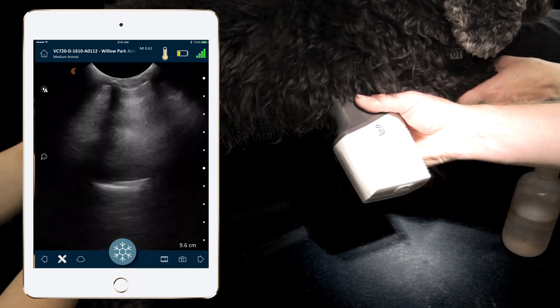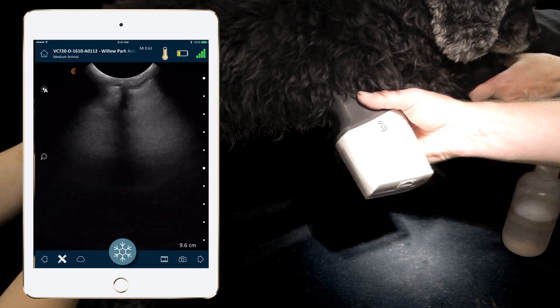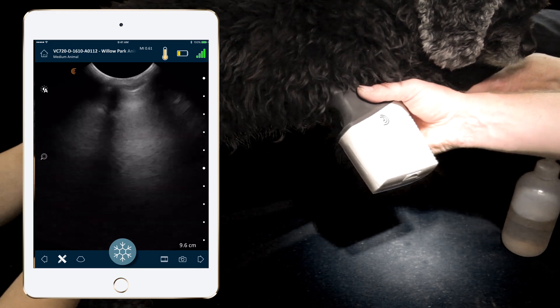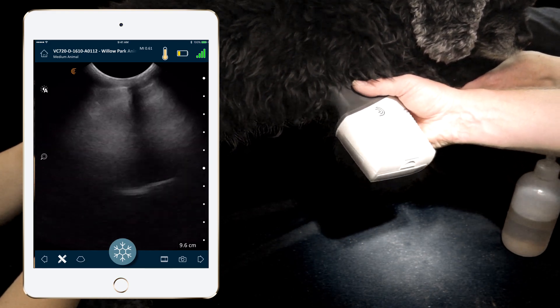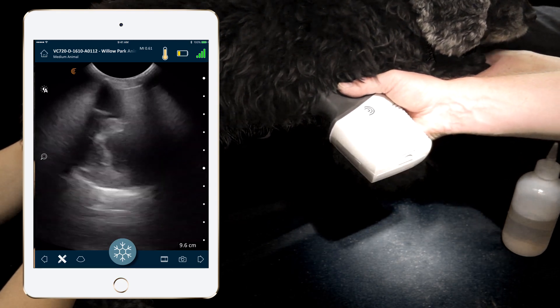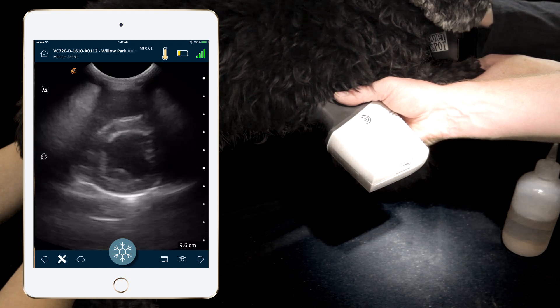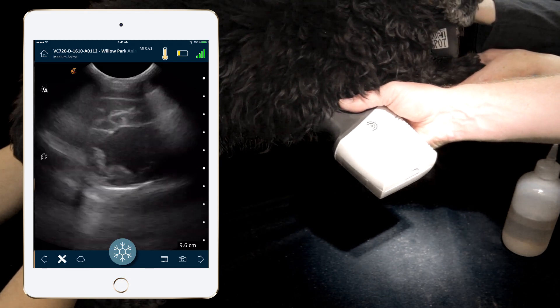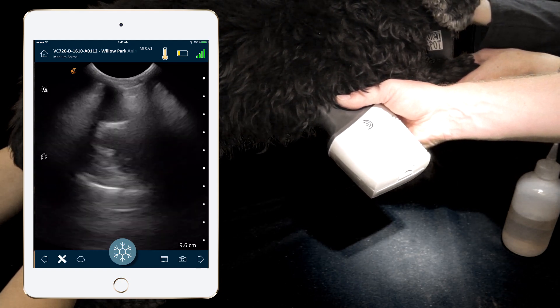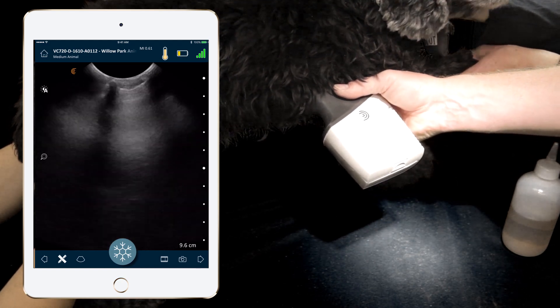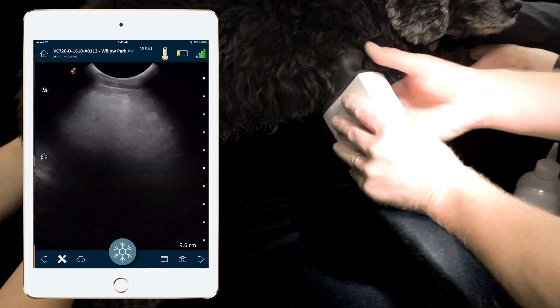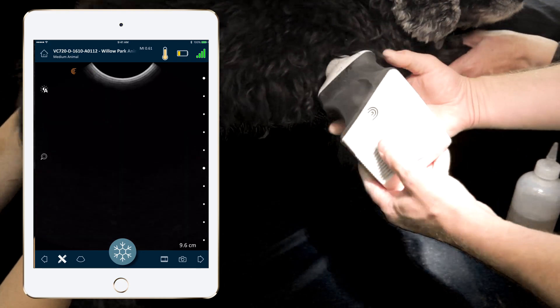Despite the challenge, here we can see the atrium and aorta subjectively appearing about one-to-one in size. If needed, the dog can be stood up or the leg moved cranially for better access. In an emergency, we typically just pick up the mushroom view, fan to the mitral valve view, and then to the aorta-atrium window. If we start with the apex mushroom view and see two chambers, any extra echo-free change indicates fluid. Moving proximally, we assess the fish mouth view and then the atrial-to-aortic ratio.